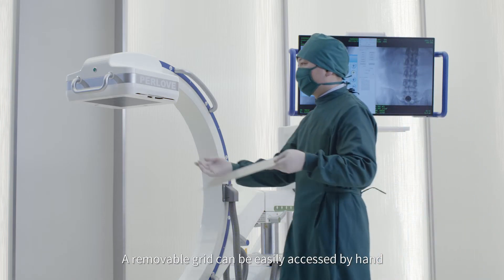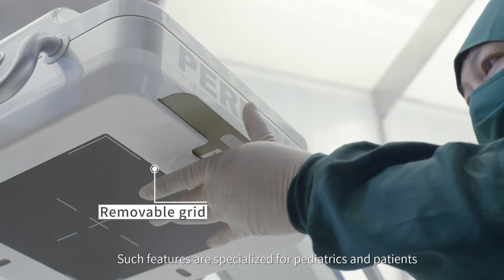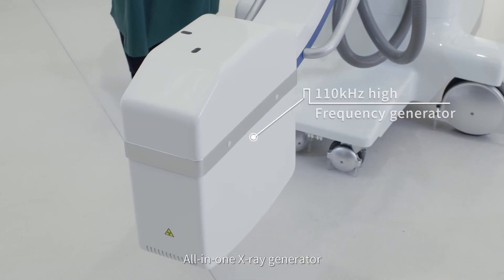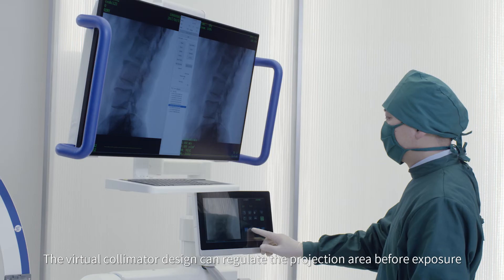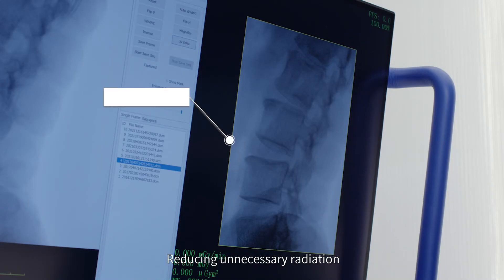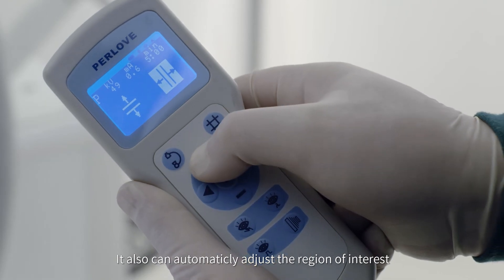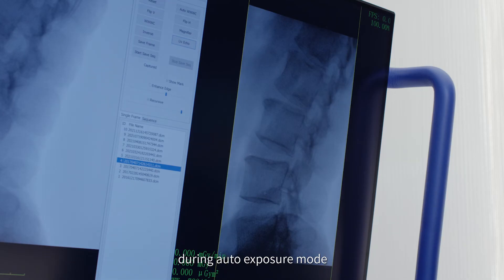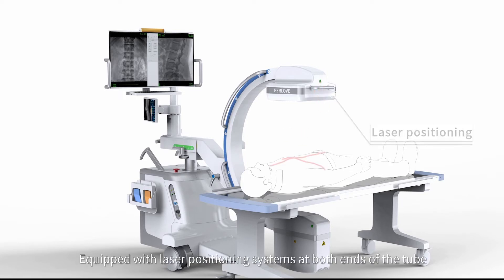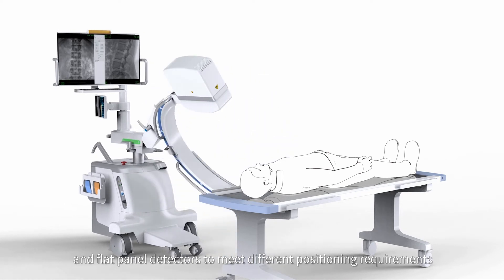A removable grid can be easily accessed by hand, specialized for pediatrics and patients with individual radiation sensitivity. The virtual collimator design can regulate the projection area before exposure, reducing unnecessary radiation, and can automatically adjust the region of interest during auto-exposure mode. Laser positioning systems are equipped at both ends of the tube and flat panel detectors to meet different positioning requirements.